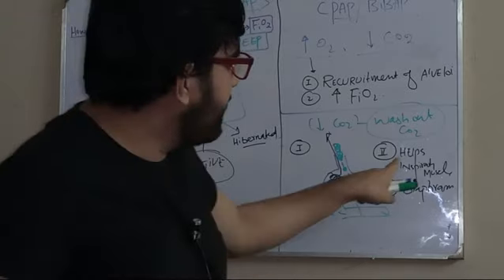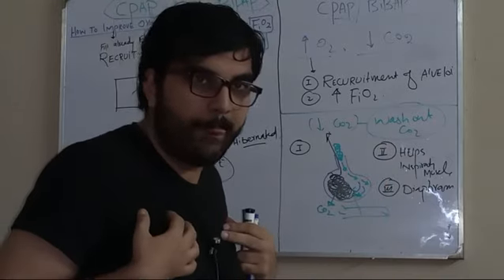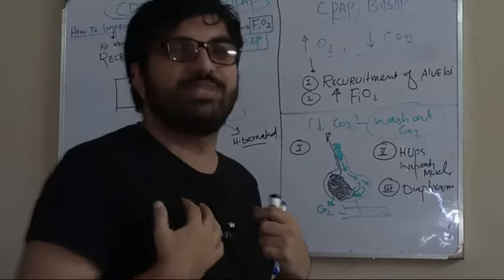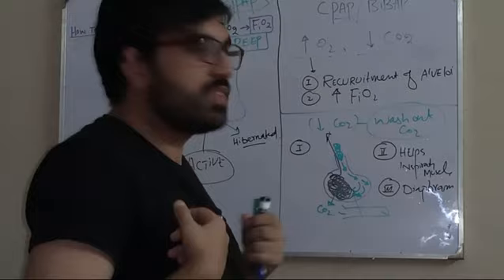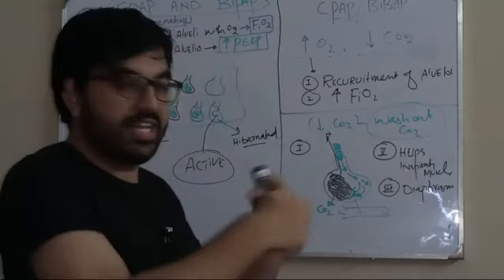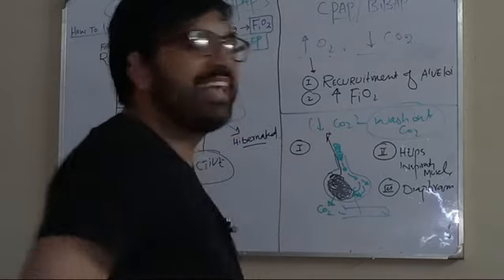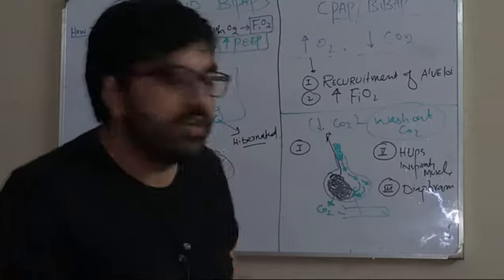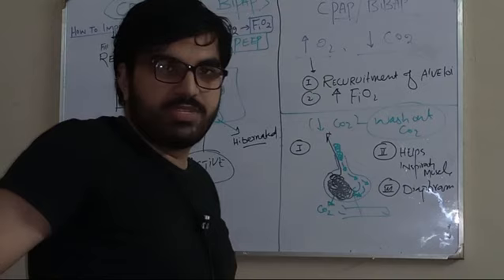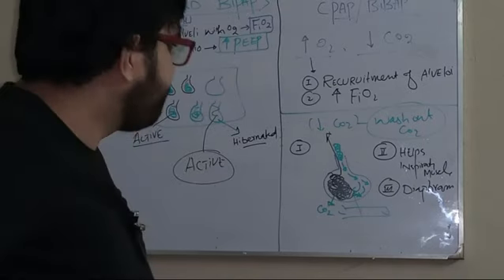The person has to apply the least amount of force, the least amount of work by inspiratory muscles, and his work is done by the CPAP and BiPAP machine. So the second answer is that it makes the breathing process very effective, and he exhales the CO2 quickly. Third, it is helping the diaphragm, because the diaphragm is already fatigued and the muscle fibers are not working, so it is taking the effort of the diaphragm.